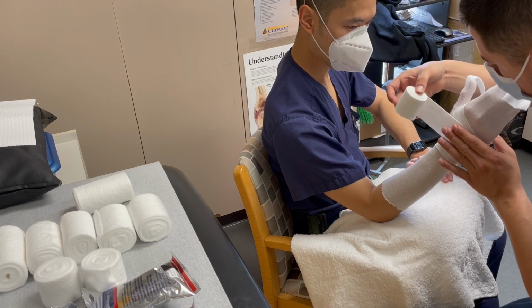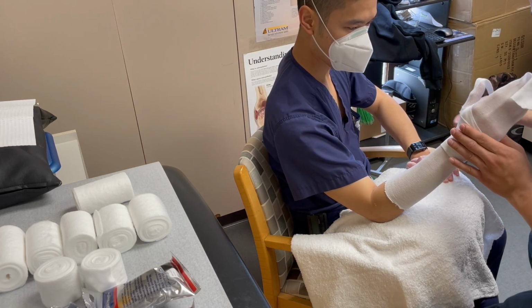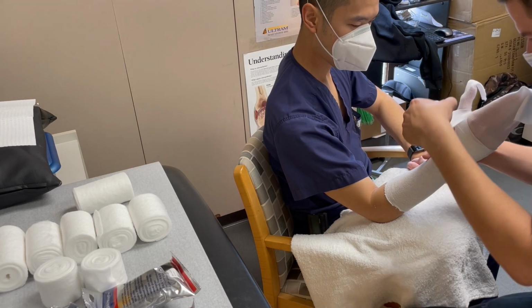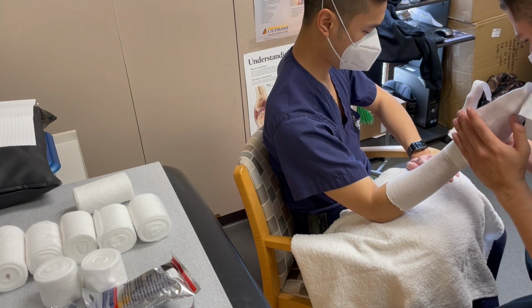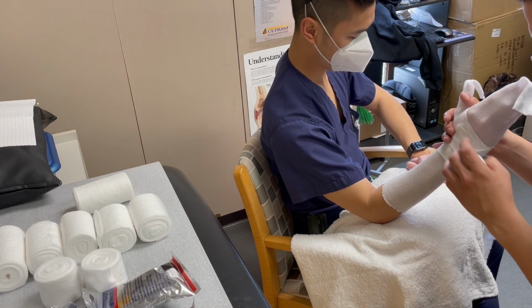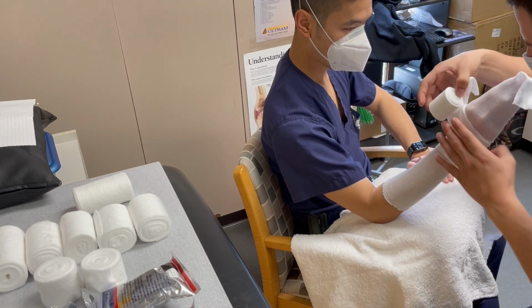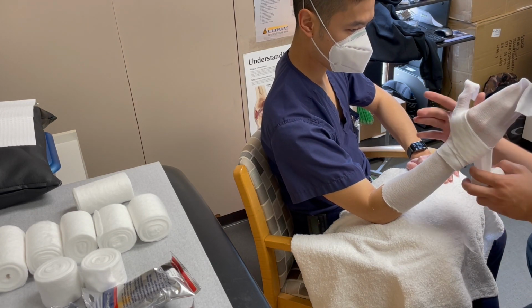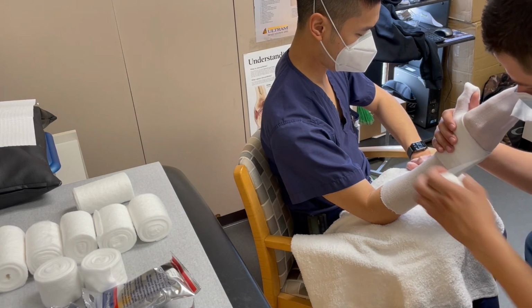As we wrap the wrist around this time, you notice after we cover the thumb, we'll make a tear again, but this time we'll lay it down in the web space in the opposite direction from earlier. We'll go ahead and wrap around the wrist, make another tear, and lay down the web space like we did the initial time in that direction.